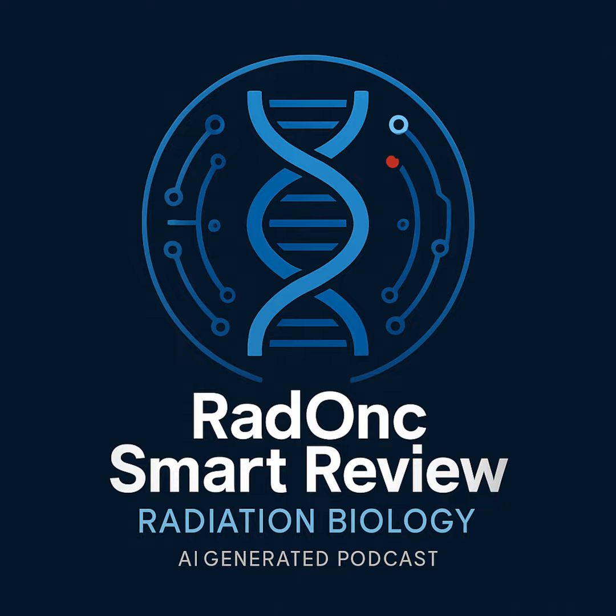Okay, the core physics of PET scan is all about detecting radiation that comes from a special kind of radioactive tracer. This tracer has a positron-emitting radionuclide incorporated into it. A positron emitter, so an isotope that kicks out positrons when it decays. Exactly. We inject this tracer, it goes where the biology happens, like glucose metabolism or hypoxia, and then the unstable nucleus in that radioisotope decays. A proton inside flips into a neutron. And out comes a positron.